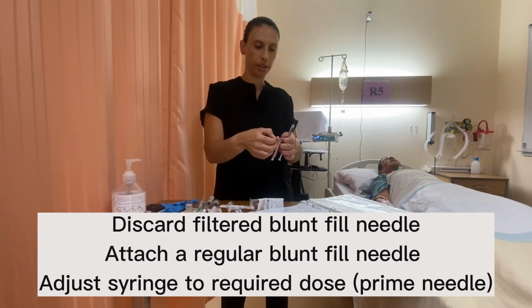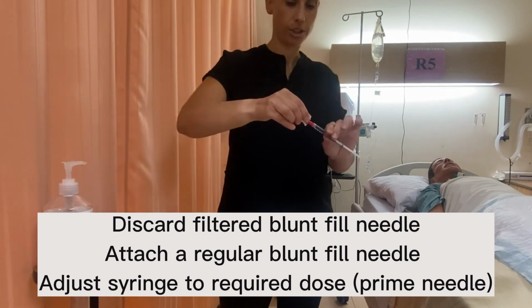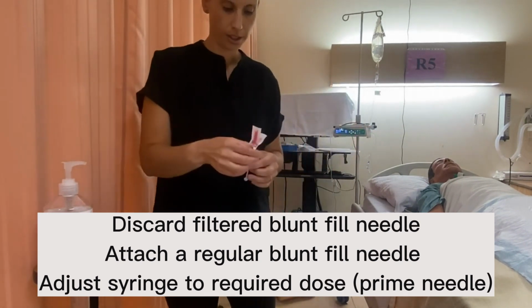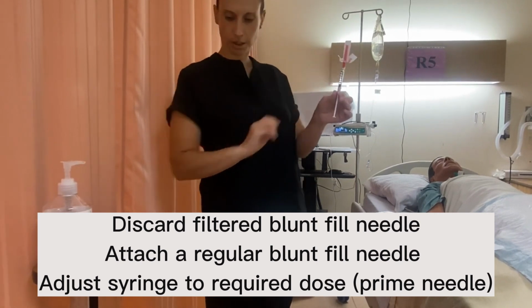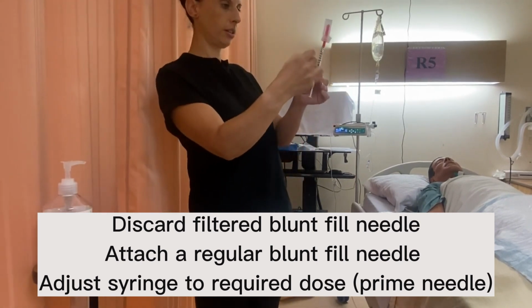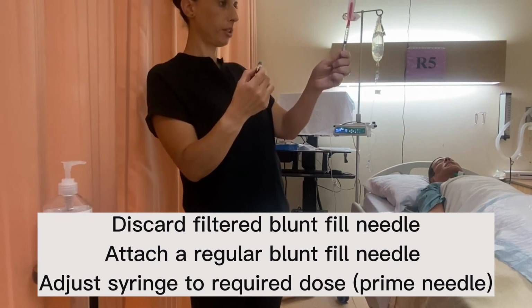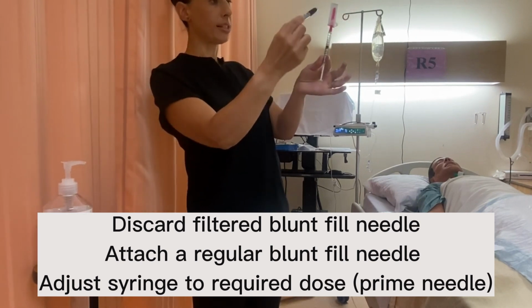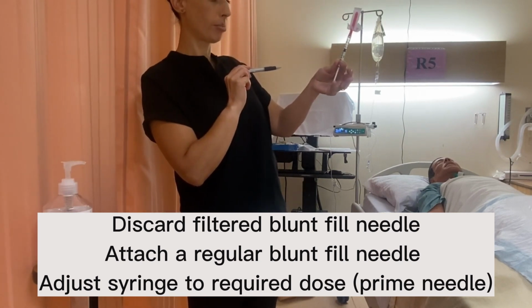I'm going to banana peel that back and attach that there, just like that. Okay. And then now we can get the bubbles out. We can tap it. Okay. And we want 0.5 mLs. So now we're basically priming this needle. Since it was a brand new needle full of air, we're going to prime it like that.